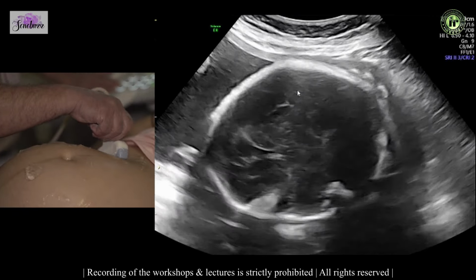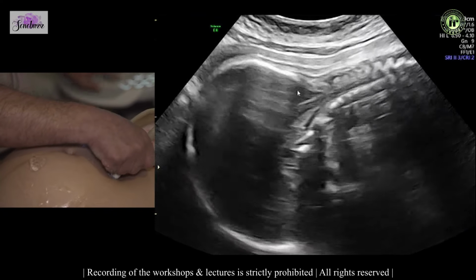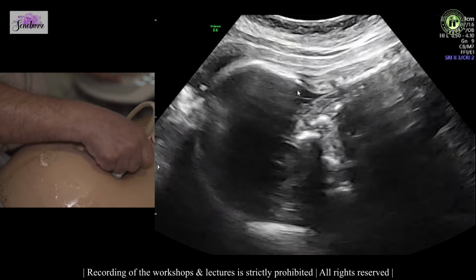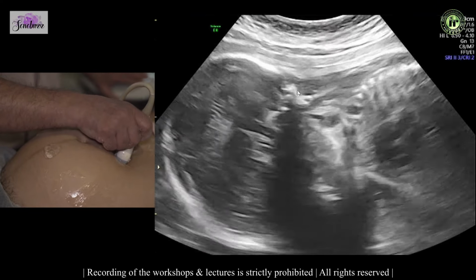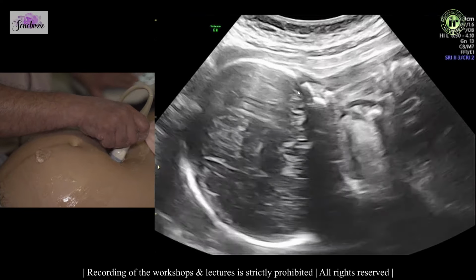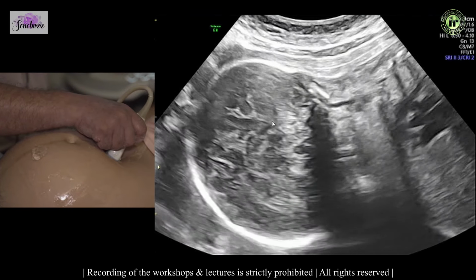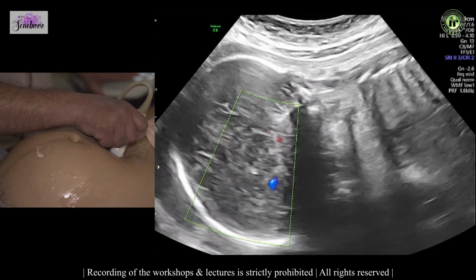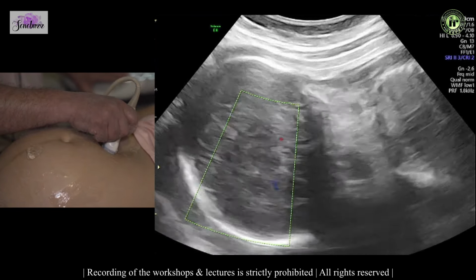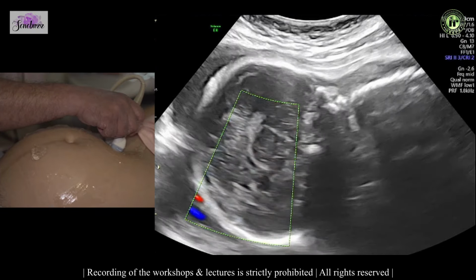The last thing left is a sagittal view, a mid-sagittal view, and that can sometimes be very difficult, especially later in pregnancy. And you can see here that we may use even color at times to identify, but we are not getting depth penetration due to the large size of the fetus.